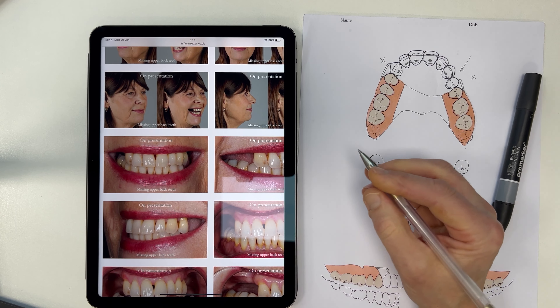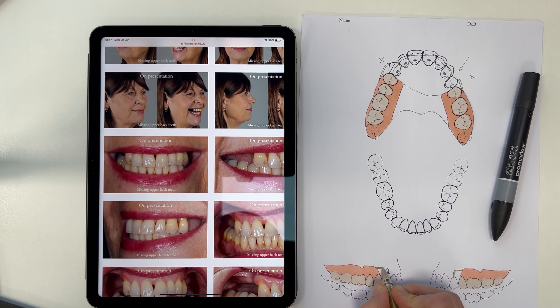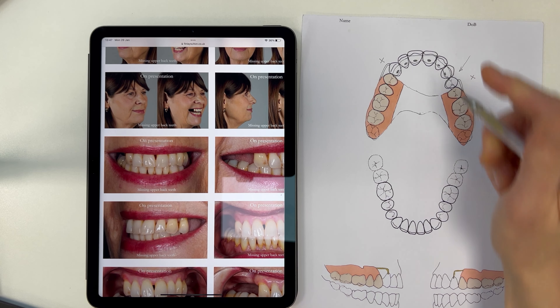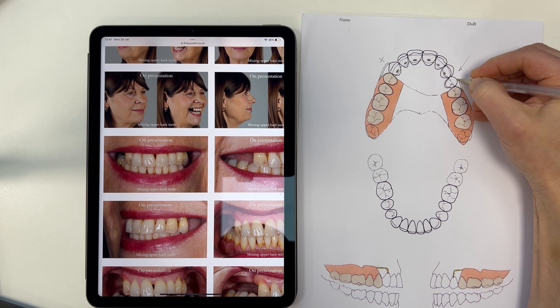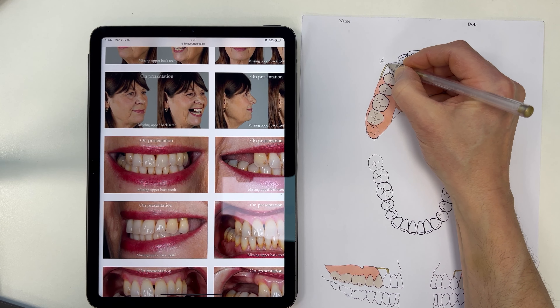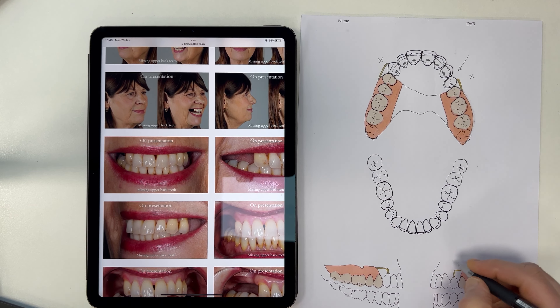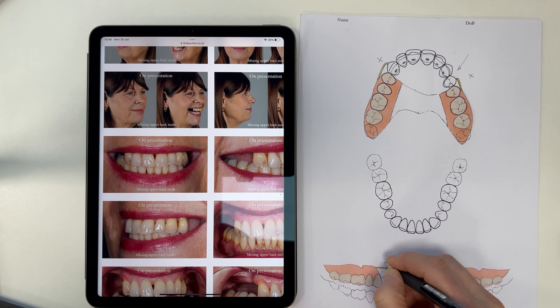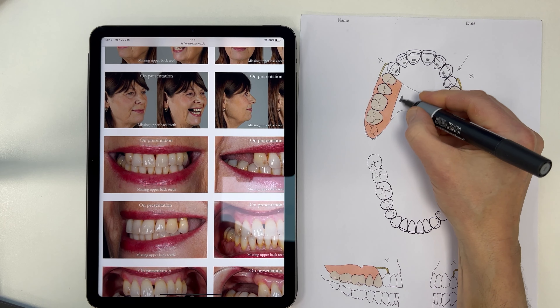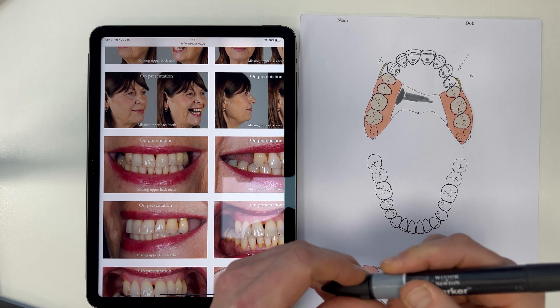I've got a nice little gold pen here — this is just a Pentel gold pen, really nice for these gold clasps. These clasps are 0.9 millimetre wrought gold, which we use just there like this. I'm going to put a little X above those teeth there to mark the retention, and then just colour in the metal base. I don't like toilet seat designs.